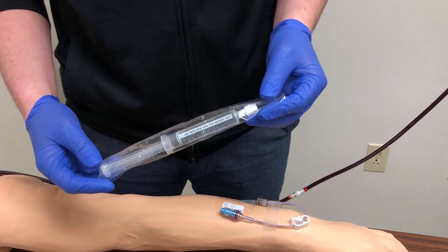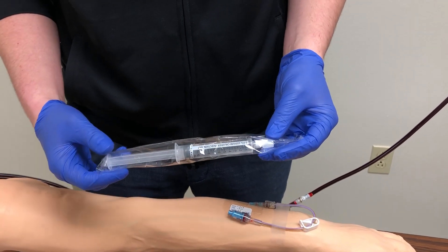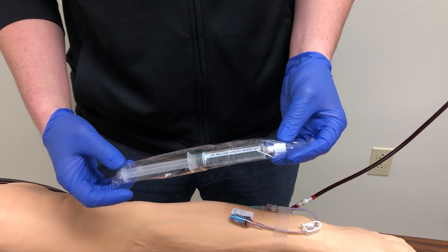Sometimes people can get careless with saline flushes because they don't view it as a medication. So remember, you still want to ID your patient, perform three checks, scan the wristband, et cetera.